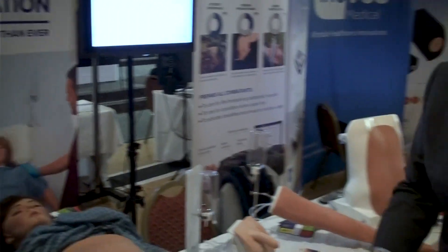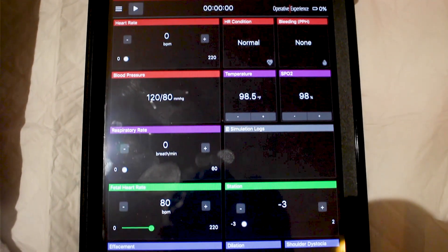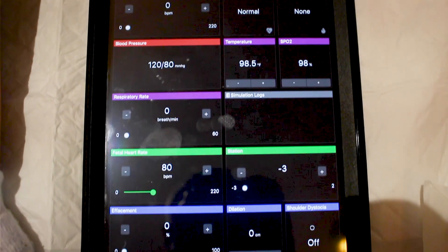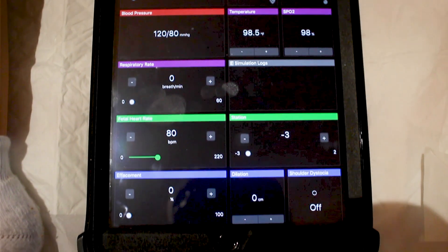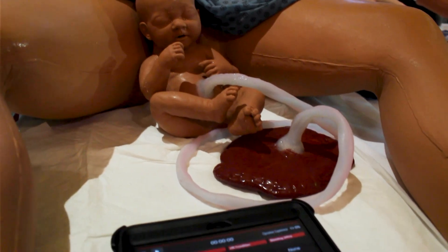We then program through here — we change the dilation and do several different things, from the settings and various controls. Once we get to 10 centimetres, it will eventually deliver the baby in a normal process.